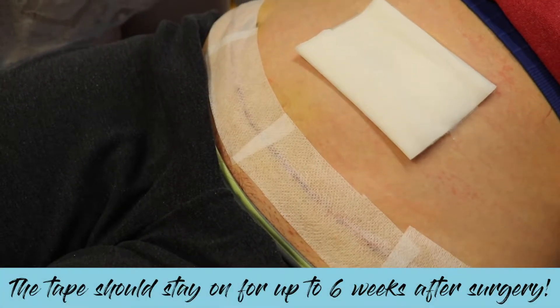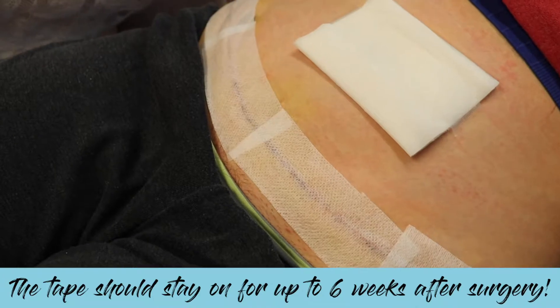We want to replace the tape every one to two weeks, or when the tape starts to fall off or get ratty. It's important not to change it too often. We want to leave the tape until there are no scabs and the incision looks more like a scar and less like an incision.